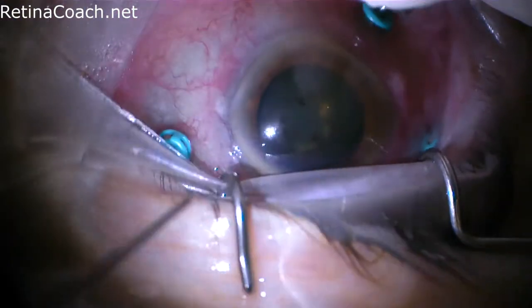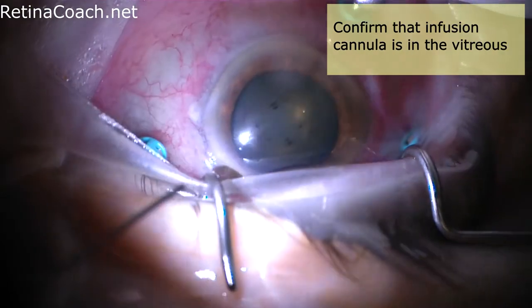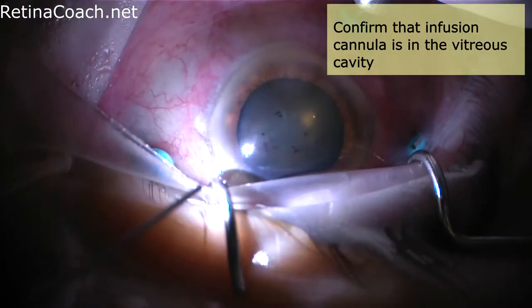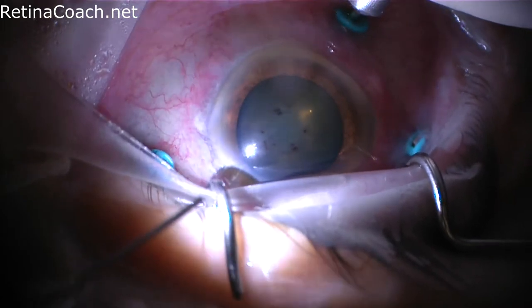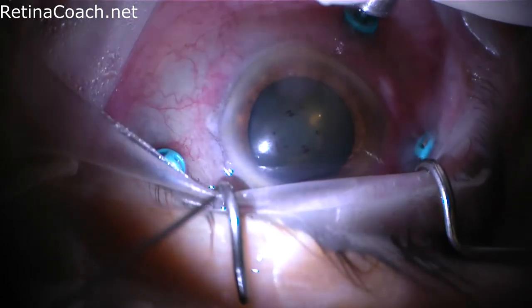Before starting the diagnostic vitrectomy, the infusion cannula should be placed and confirmed to be in the vitreous cavity. The light pipe can assist in cases with opaque media.